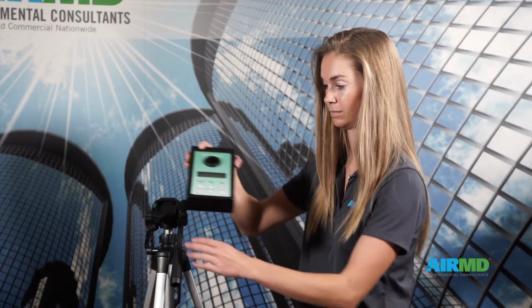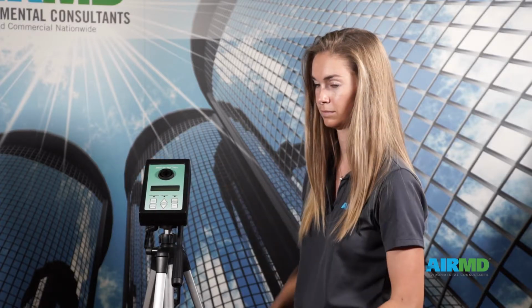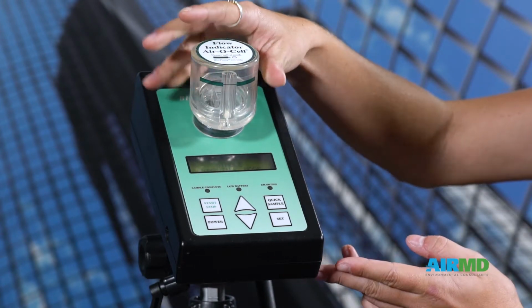To collect the bioaerosol samples, set the tripod and air pump in an open area of the location to be sampled. The first step is to calibrate the pump. Turn on the pump and attach the rotometer to the pump.